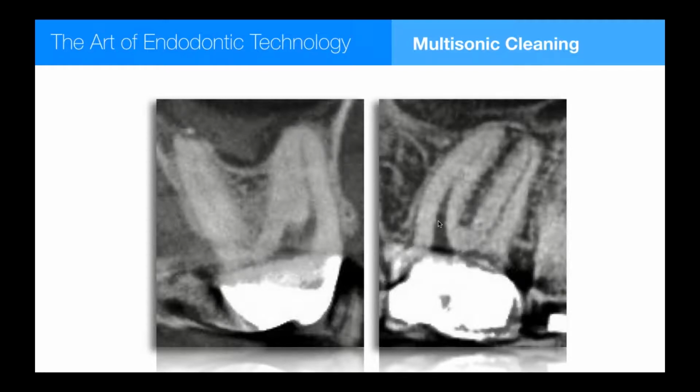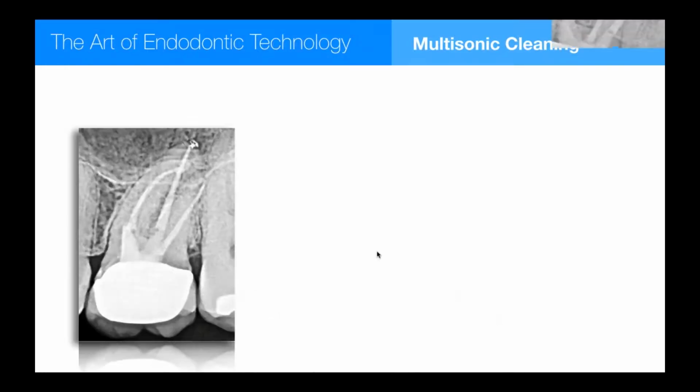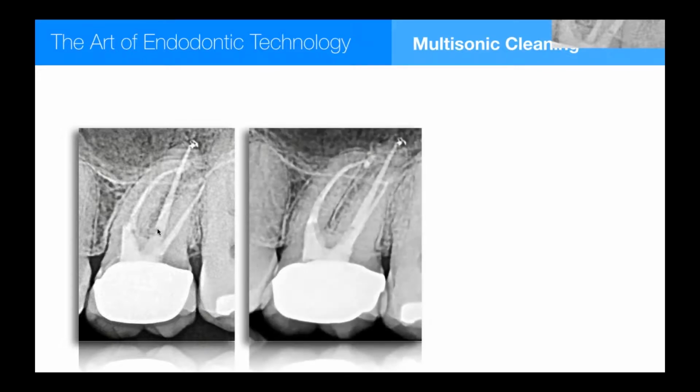And that's because when I did the initial gentle wave cleaning, when I couldn't find the canal, I did a gentle wave procedure about a third of the way through it, and then saw a little bleeding point that perfectly pointed me to the MB2 canal. It was present and clean enough for a little bit of blood to come out of it and indicate its presence. It was still too small to ever get a file into it. I never did make that happen.